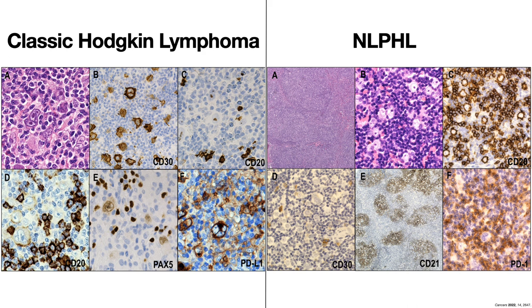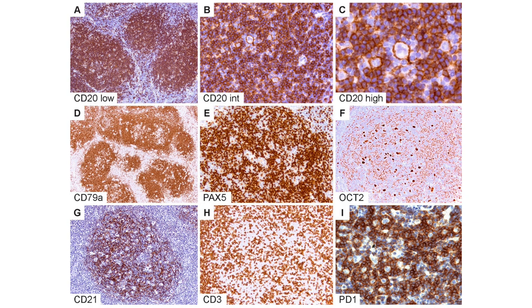In figure E, CD21 highlights the follicular dendritic cell meshwork within the nodule, which is a key feature of nodular lymphocyte predominant Hodgkin lymphoma. In figure F, the LP cells are characterized by rosetting of PD-1 positive T cells. This rosetting pattern can also be seen with CD57, but PD-1 is much better.